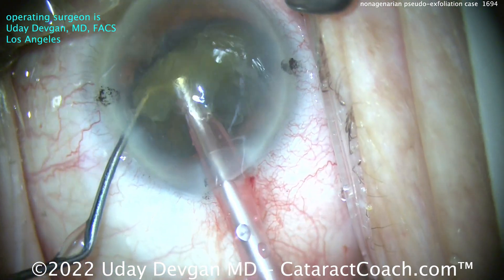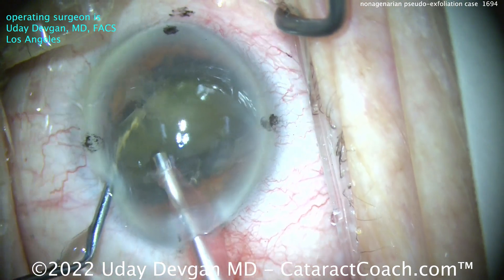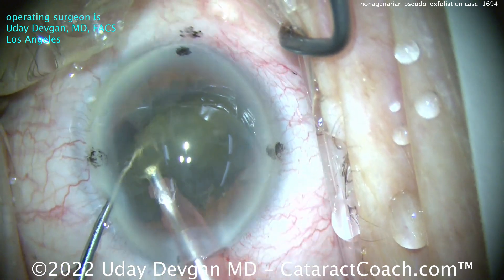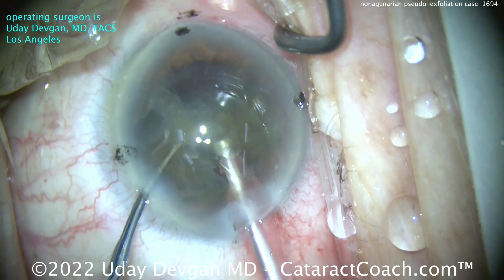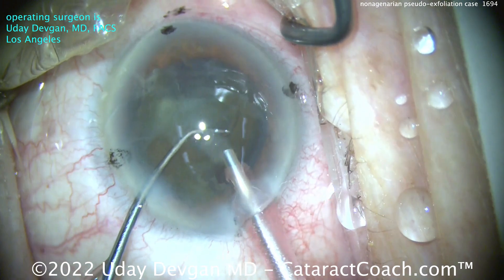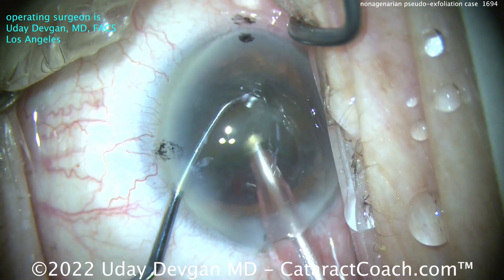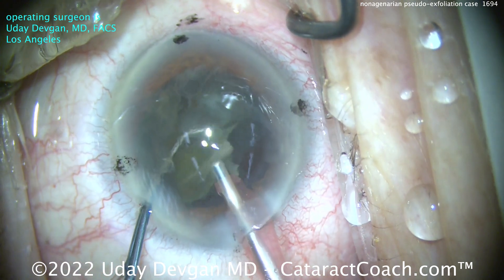Surprisingly, not that dense of a cataract for someone who's in the 90s. Nice and easy — taking out that lens material, being very judicious with the phaco energy, cautious, and just aspirating it out. I want to get that one half of the nucleus out first; it'll give us a lot more working room so you can get these little fragments out as well. About one hemi-nucleus has been removed, and there's a second hemi-nucleus. We're going to bring that up, go with the chopper behind it, chop off a little piece if needed, and fully aspirate this down.